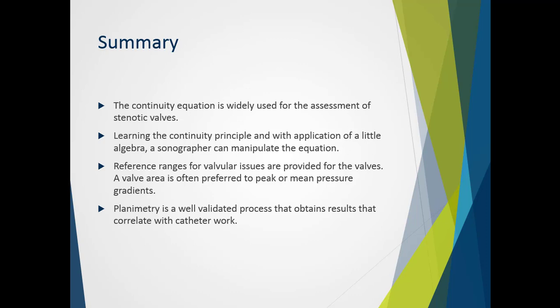However, care needs to be given by the sonographer to ensure the measuring is on face, on the correct frame, and actually at the leaflet tips.